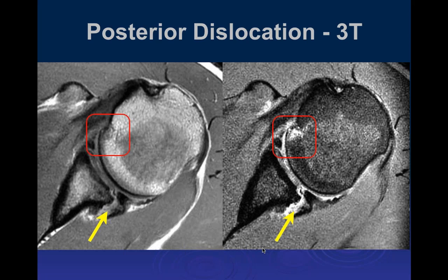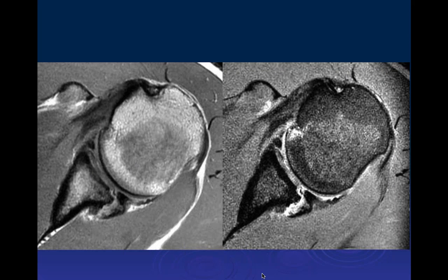John, do you have any comment on this one? This would need to be fixed because I don't know what the measurement is of the separation of the glenoid injury, maybe 3 or 4 millimeters. Right. But that looks to me like there's a little posterior subluxation of the shoulder. Yes. And that has to be fixed. Good. Does the 25% rule still apply for posterior dislocations? I don't really go for the 20% rule. When you have a subluxation, everything is discombobulated. It's not just one item that you see.